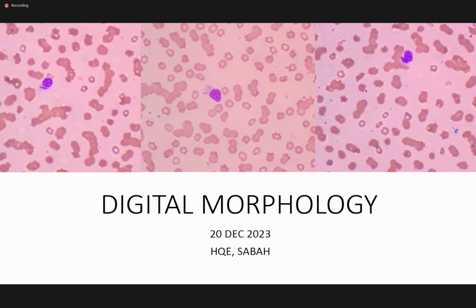Today we are going to present about this plasmacytic dilemma. Our main theme for today is plasmacytic dilemma. As you can see on my screen now, there are three pictures showing plasma cells with Auer rod-like bodies.